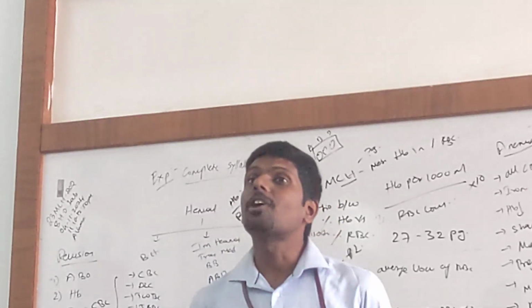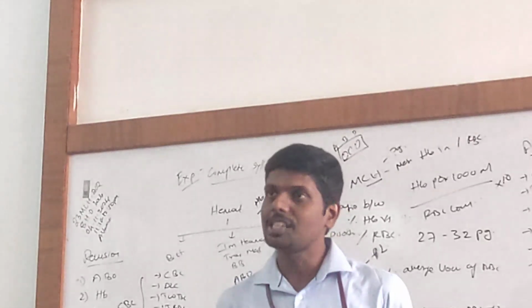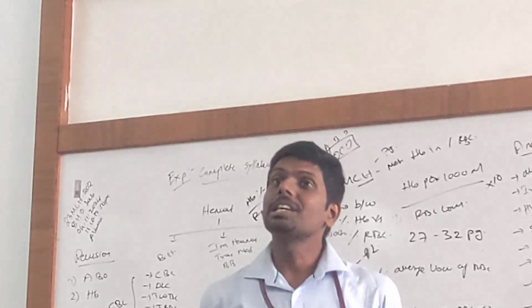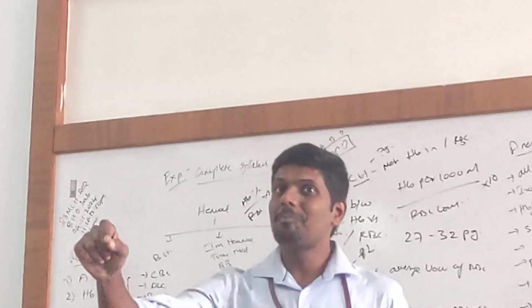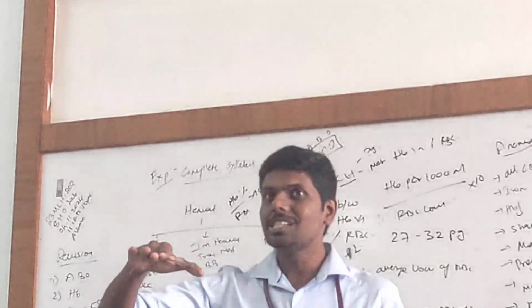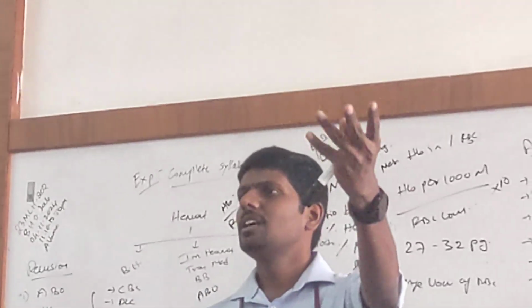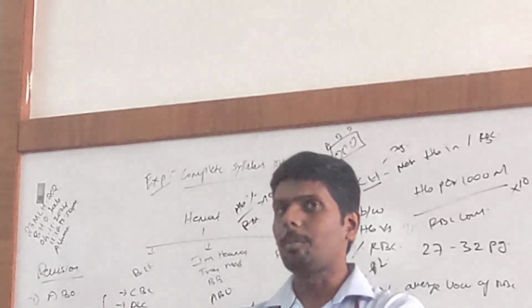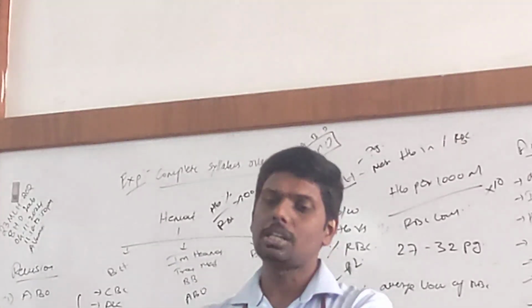Romanowski stains are the stains we are widely using in hematology lab. Keep in mind first, whatever stains we are using in hematology lab, they are Romanowski stains. And the primary characteristic feature of Romanowski stains is that these are dyes suspended in alcohol medium. Do you remember? Alcohol-blended dyes are Romanowski stains. Their base is always alcohol. So all our hematology stains have OH, alcohol suspended stains. Very good. Now you know what Romanowski stains are, right?